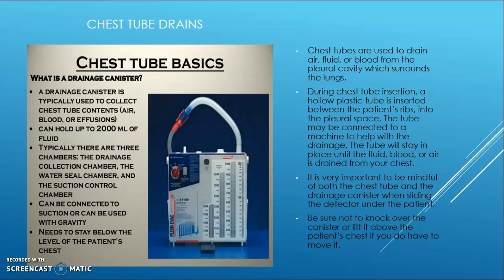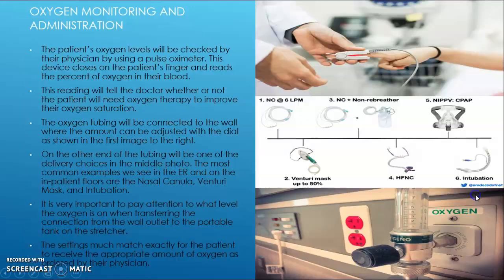We do not want to knock the canister over or lift the canister above the patient's chest. So if that happens, everything we're trying to suck out of them will go back in, and that's very bad.